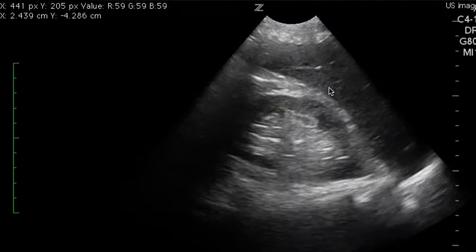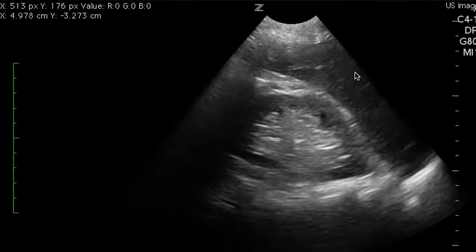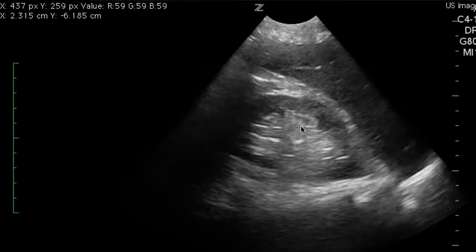This is a FAST exam. This is, I believe, the right upper quadrant. You can see your kidney and either the liver here, if this is the left, and this is the spleen.